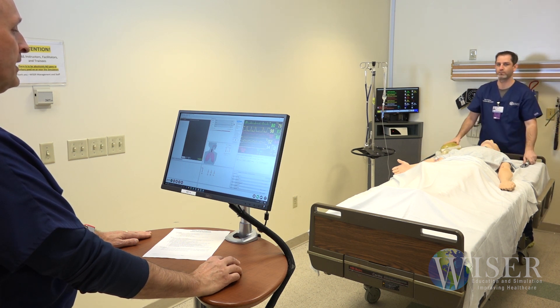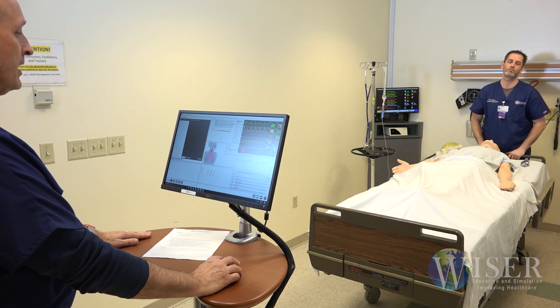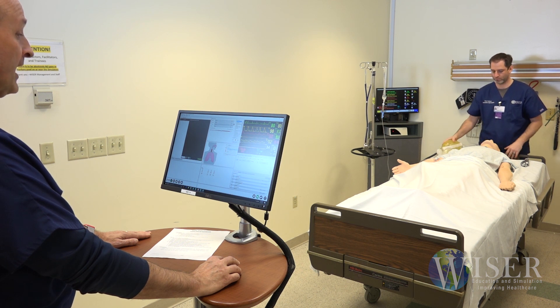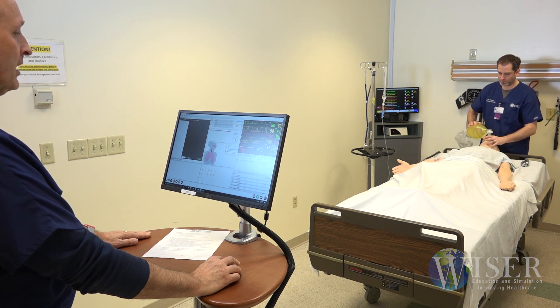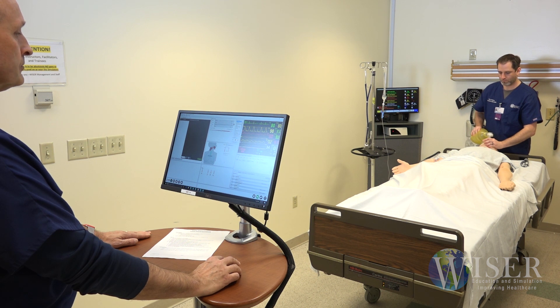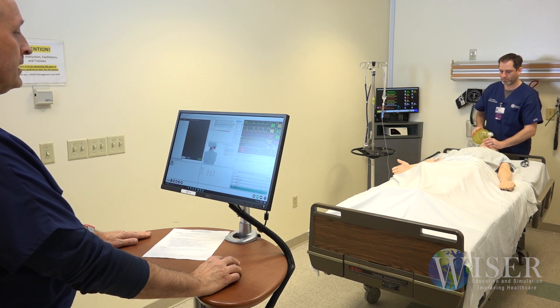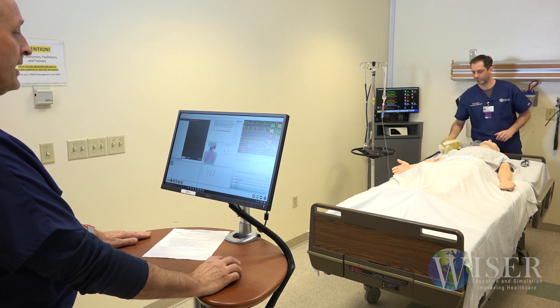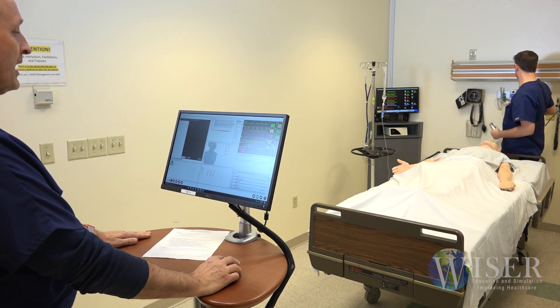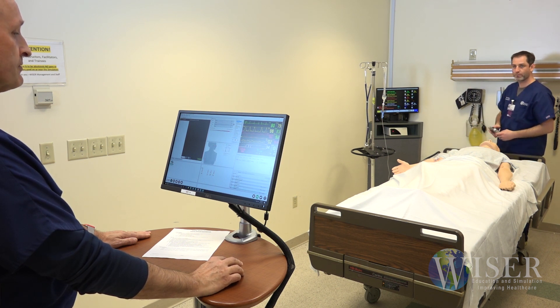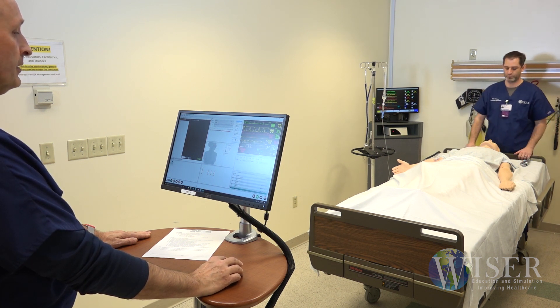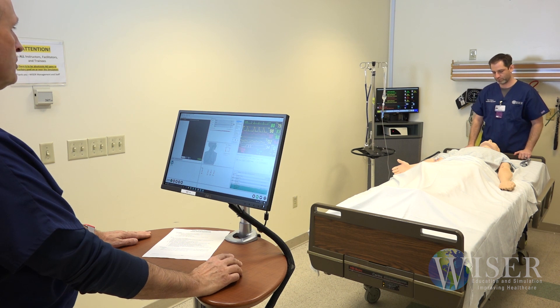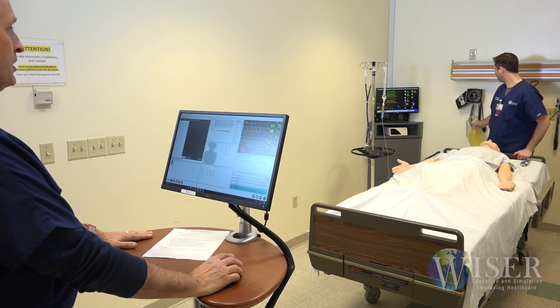We then test for a cannot-intubate, can-ventilate airway, followed by a cannot-ventilate airway scenario. After that, we go back to a normal airway and test to confirm that we are getting a CO2 trace on the patient monitor.